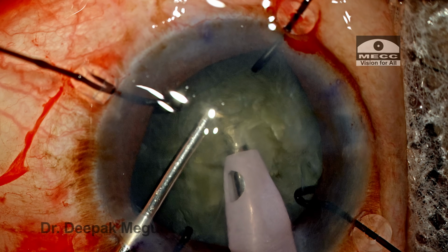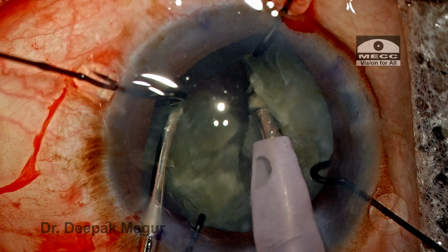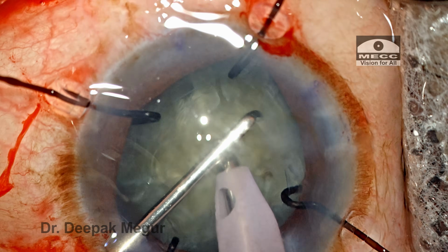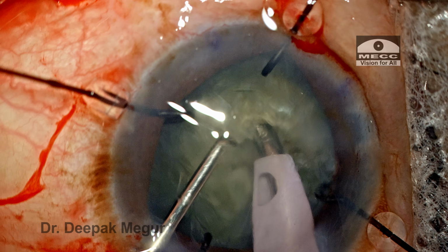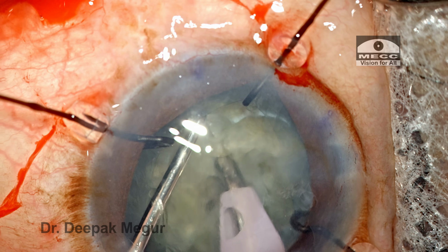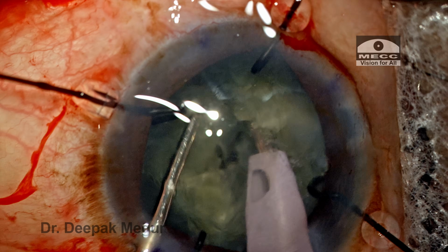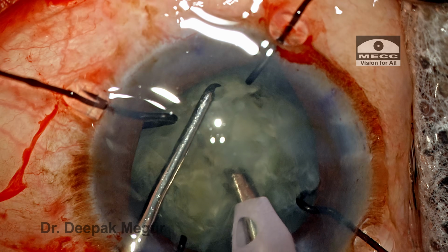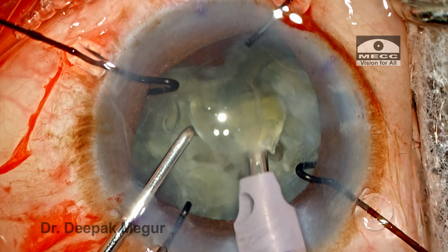The process of dividing the nucleus is continued until I have about 6 small fragments. The visualization is not great, I must confess, maybe because the capsule staining was not done very well. So during the chopping maneuvers, I need to be very mindful that the chopper does not go in and hit the rhexis margin. Once the fragments are divided, time to emulsify them.